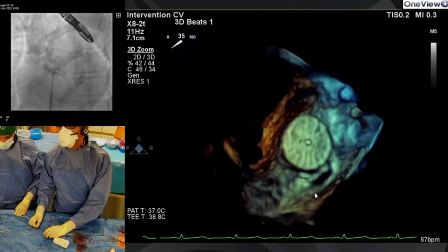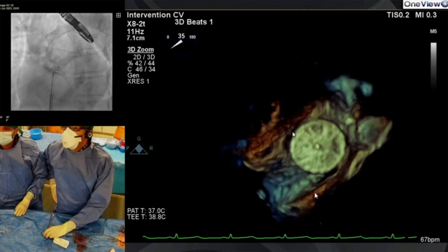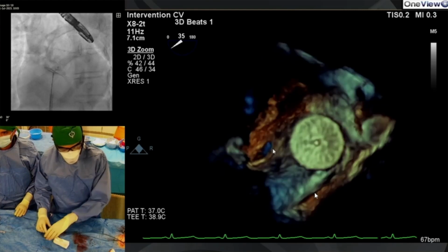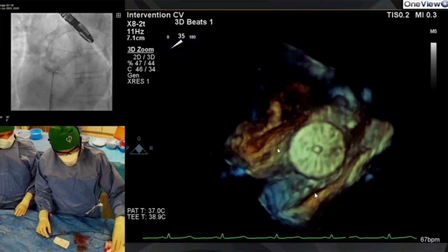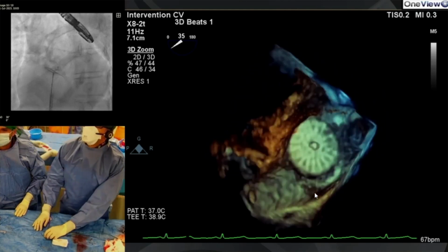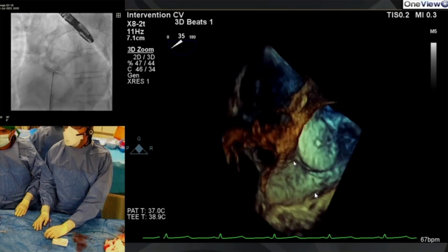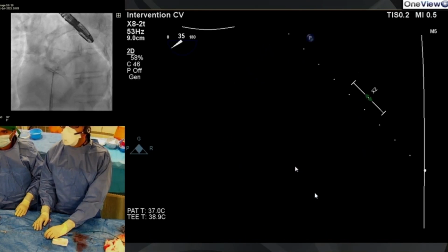And looking at the other side, the disc looks really nice there, and that's the point I think Dave is making about the aorta as well. So it's not protruding onto the aorta, which is here. I'll just turn the gain up a bit so you can see that better. If it was sitting here, then what we worry about is it would mean this device is being wedged open at an angle into this region here. So far on 3D, it's actually looking really nice.